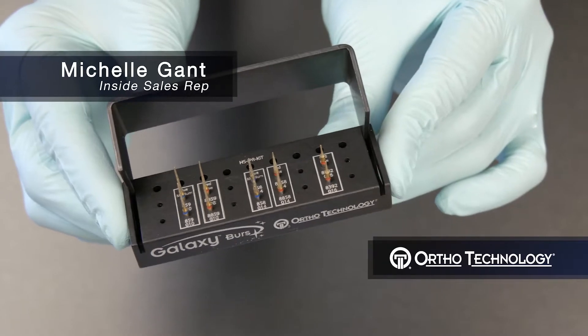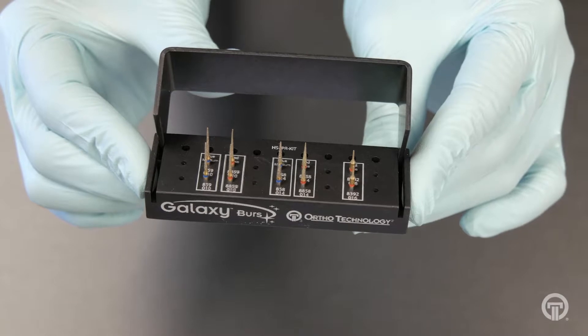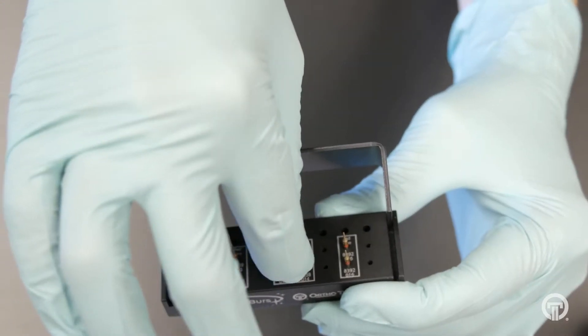Hi, my name is Michelle Gant. This is our Galaxy Interproximo Reduction Burr. It is available in a fine or medium grid.